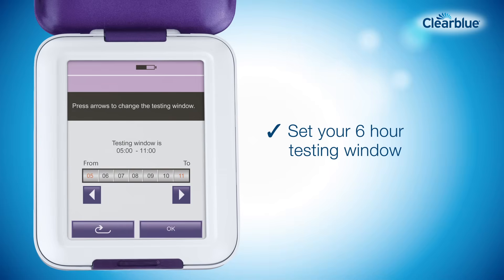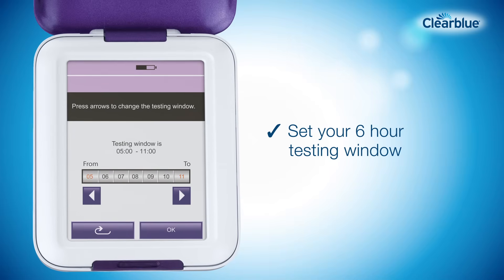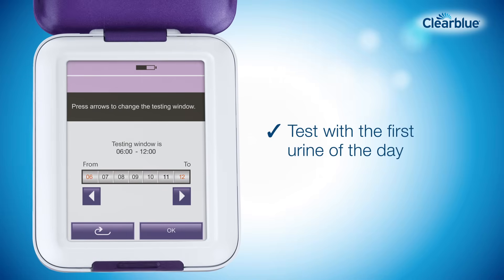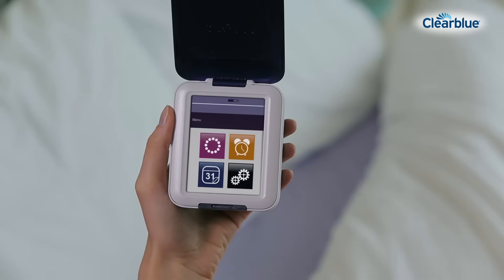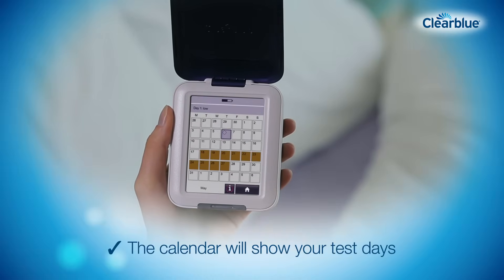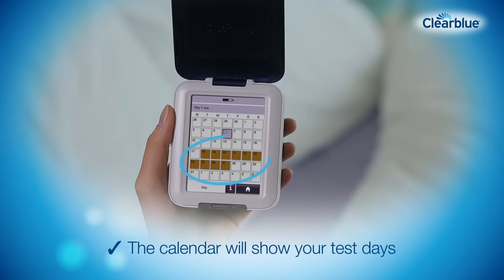You'll also need to establish the six hours each day during which you can test. This is the testing window. This should be set so it's convenient for you to test the first urine of the day. Once you've set up a new cycle and your testing window, the calendar will show your test days. You'll only need to test on the days indicated by the monitor.